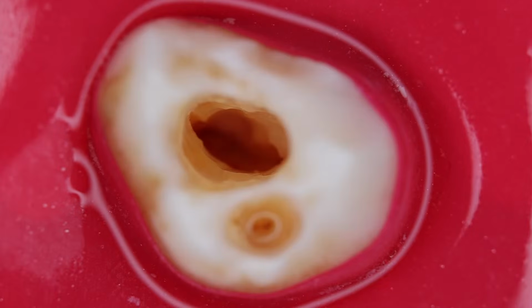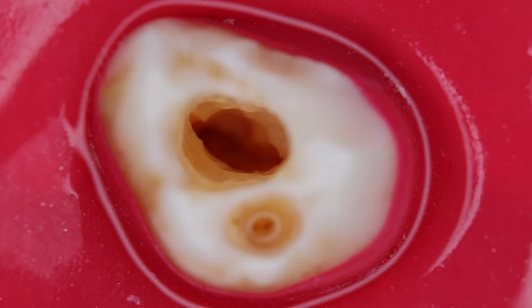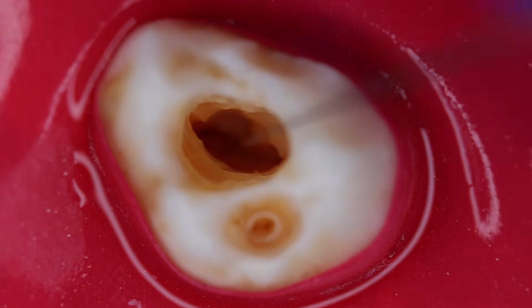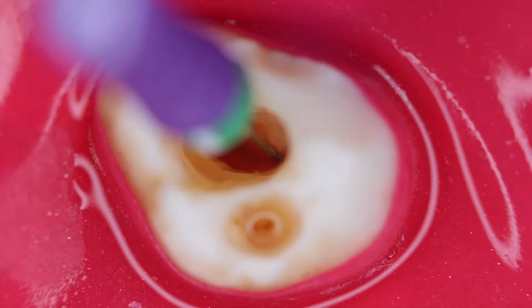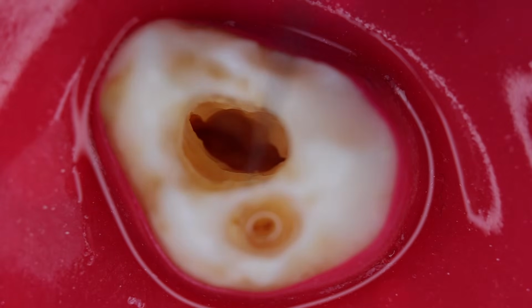So this is the time you can introduce a reamer file, or a 10K file, to negotiate the canal once you have identified the orifices. You can start with the larger canal if you have difficulties. So first, this is the palatal canal. As you can see, the reamer goes smoothly inside. No need to press it, as you have not yet taken the working length. Just negotiate the canals. So this was the palatal one.